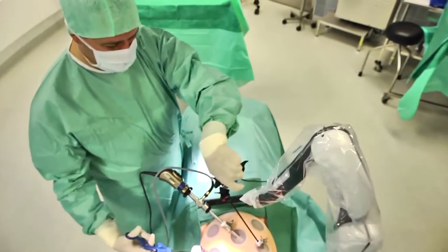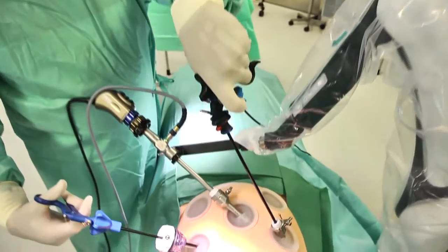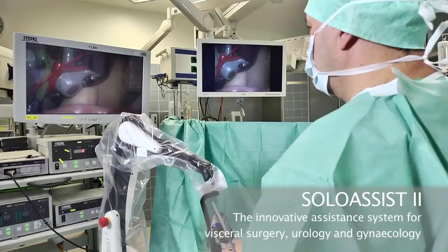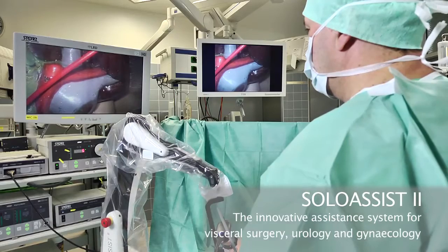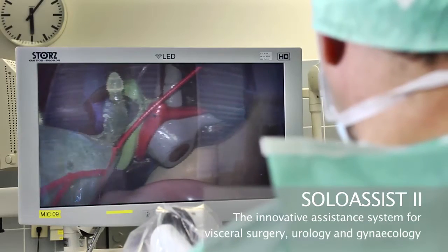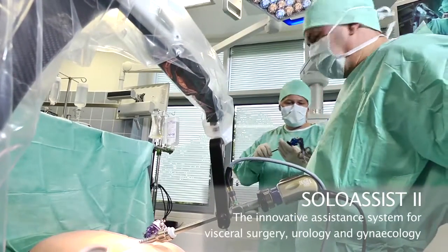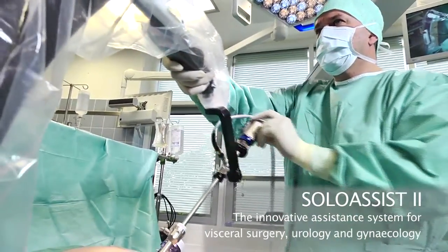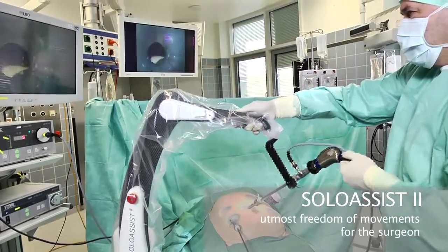Active support for surgeons in a host of laparoscopic interventions — this is what Solo Assist Next Generation, made by Actormed, stands for. With this robotic assistance system, the endoscope can be held and positioned steadily and reliably. The result is an excellent shake-free image on the screen during the entire surgical intervention. Solo Assist is suitable for both classic MIC interventions and single port. As a surgeon, you are always in the picture and can observe the entire situs from all directions.